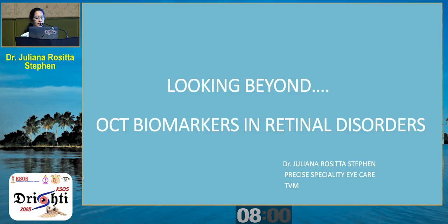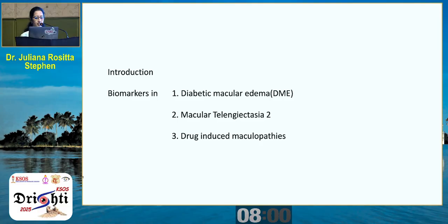Good morning. Looking beyond OCT biomarkers in retinal disorders. So I'll be discussing the OCT biomarkers in diabetic macular edema, macular telangiectasia type 2 and drug-induced maculopathies.